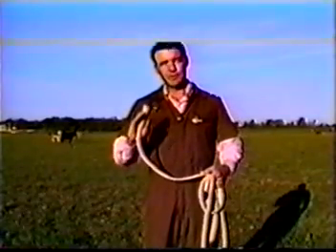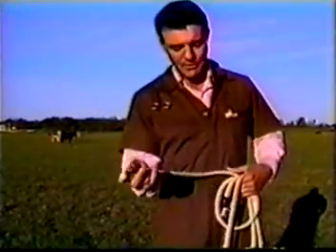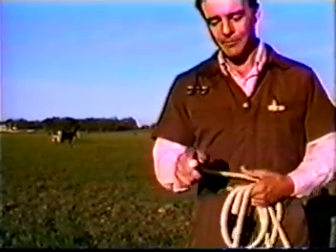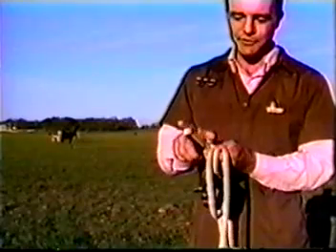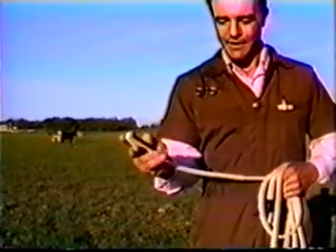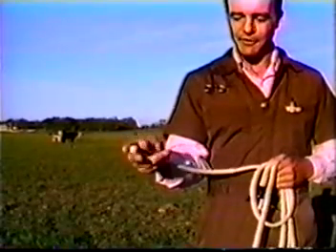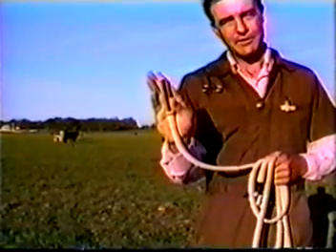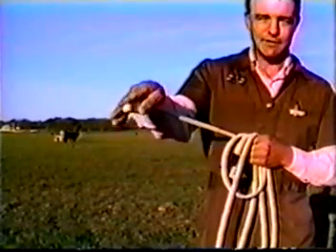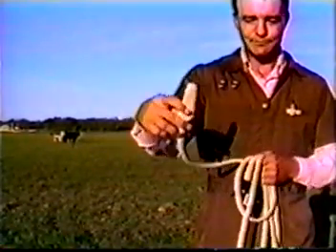As far as how we position this in my hand to go in the rectum of the cow, I'll get a little closer and show how I hold the unit. I'm a right-handed transducer holder, and I normally put the back ridge of the transducer along my index finger, and I use my index finger as a guide to go into the rectum. And I use my other hand, the other part of my thumb and fingers, to funnel or cup the unit within my hand. And this is the way I hold going into the cow. As I get into the cow, I continue to use my index finger as a guide, again along the back ridge of the transducer.